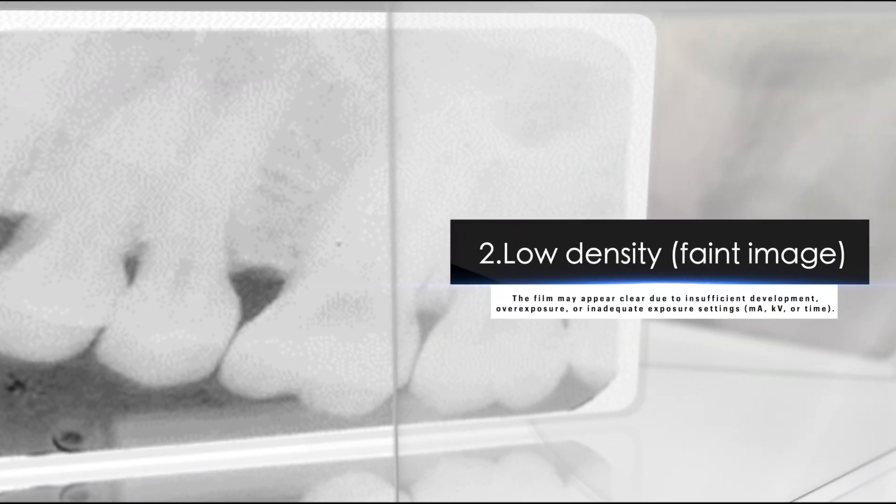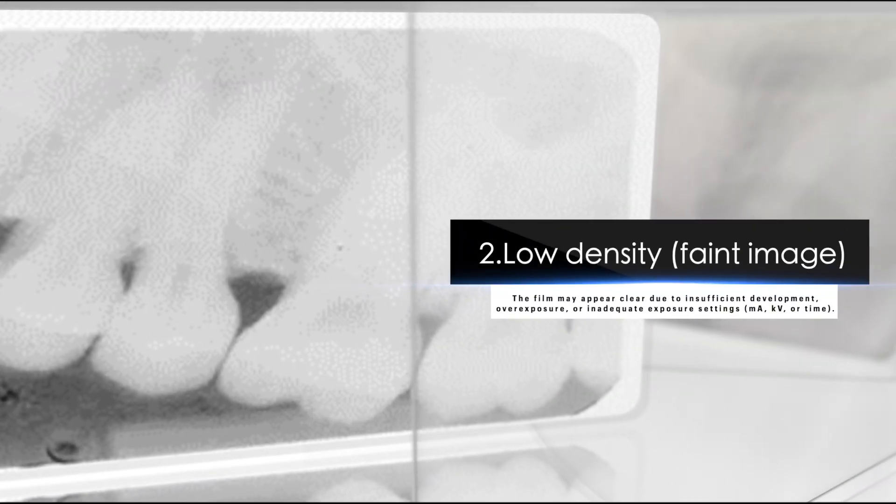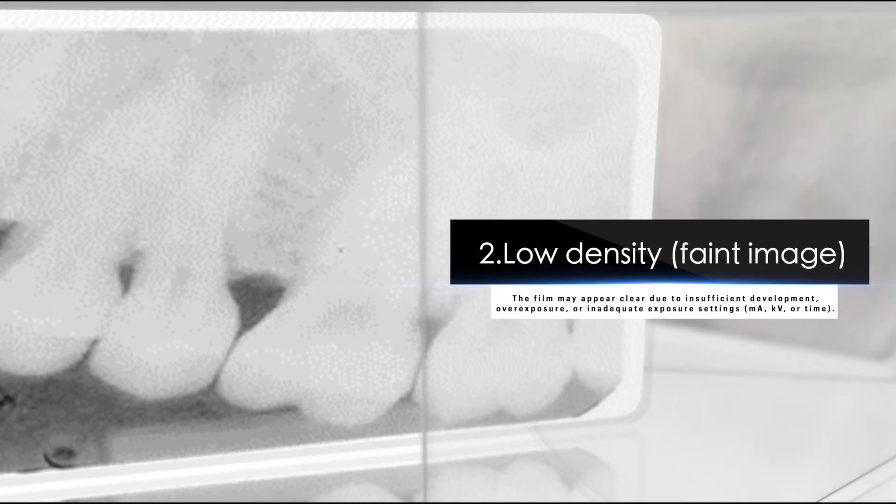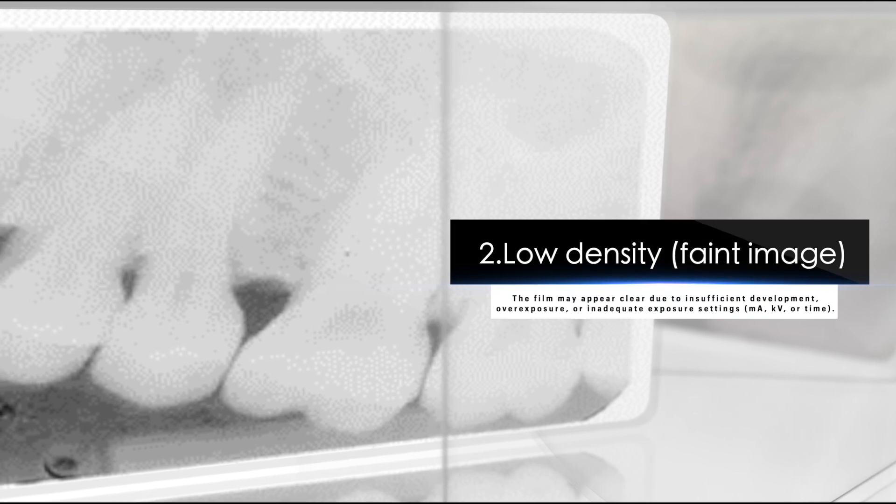Two, low density or faint image. The film may appear clear due to insufficient development, underexposure, or inadequate exposure settings: MA, KV, or time.